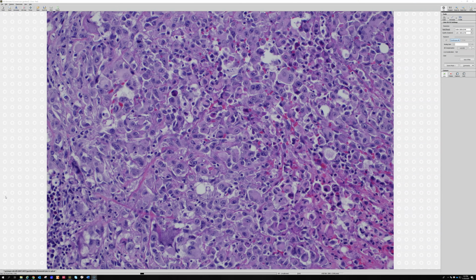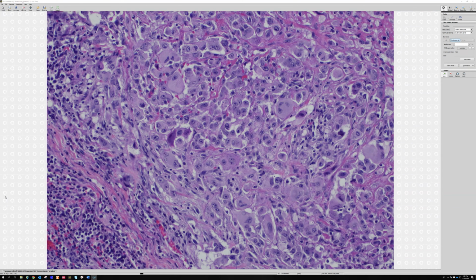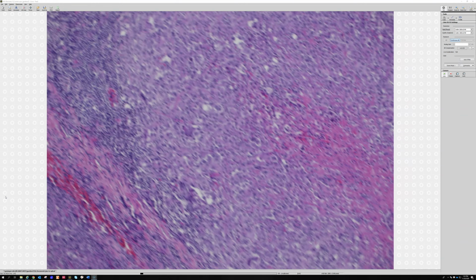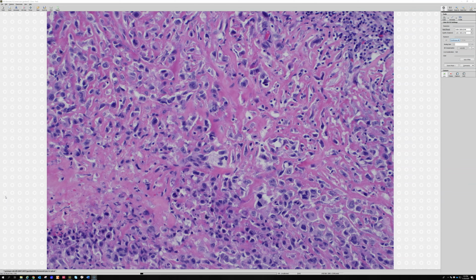In any case, this is epithelioid sarcoma, and there's a variety of different epithelioid soft tissue malignancies that can come into the differential with this, which is a little outside the scope of just one video. A lot of the sarcomas that have epithelioid features stain with keratin, which is particularly frustrating and problematic. These tumors also have loss of INI1 or SMARCB1 in the vast majority of cases. There are some rare exceptions that have an alternative, SMARCA4, I think, or BRG1, that can be lost.